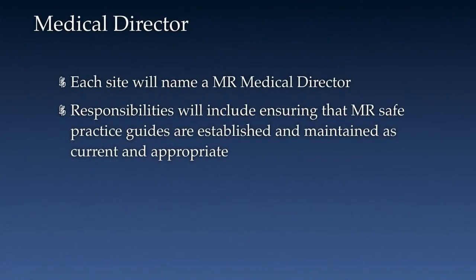Each site needs to name an MR medical director, and a big part of the responsibilities of the MR medical director is to ensure that MR safe practice guidelines are established and maintained as current and appropriate. So, do you have an MR medical director? Do you know who it is? Do they know they're the MR medical director? This is a good place to start.